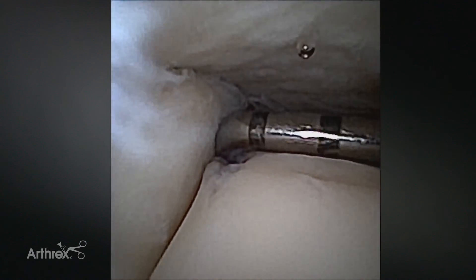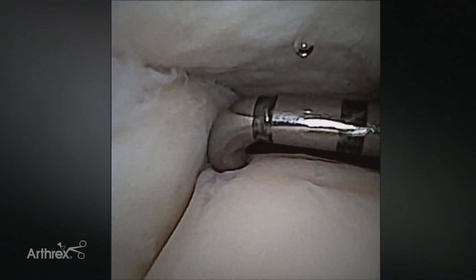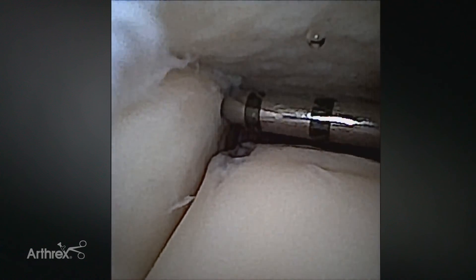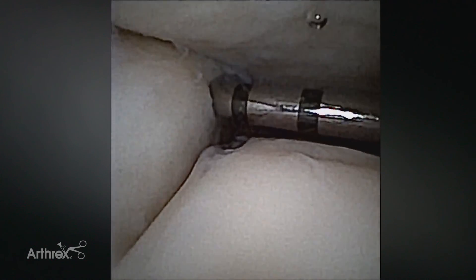We look over at the medial malleolus. We can take a look at the lateral ankle and look into the area of the syndesmosis right here. This patient does have an osteochondral defect on the lateral dome. If we were to stress the ankle and rotate the foot externally, this area here would show separation. This patient is stable.